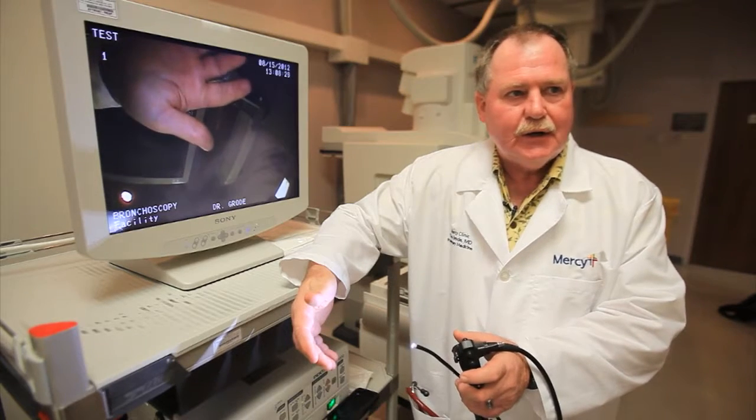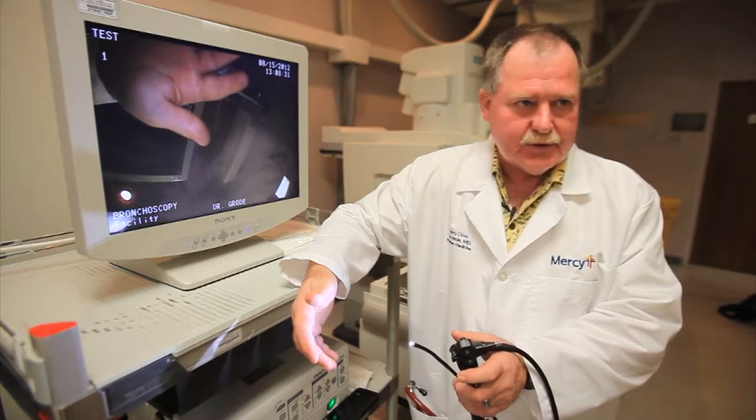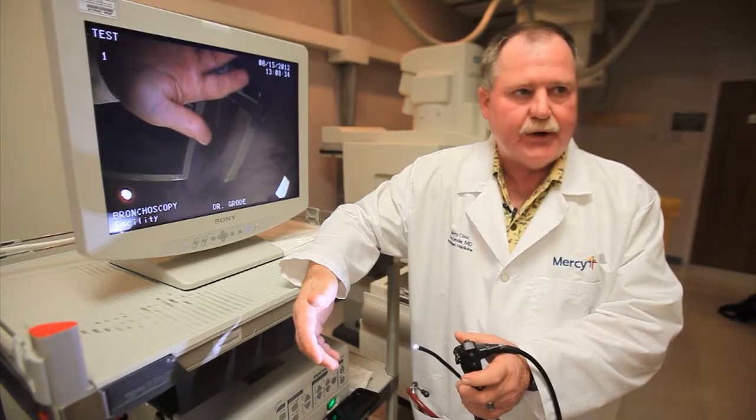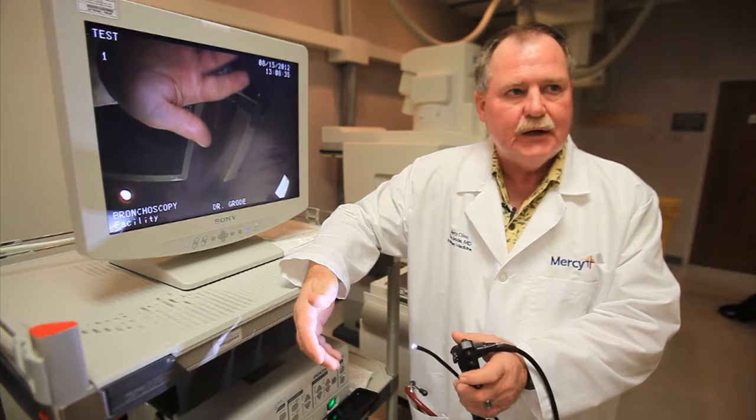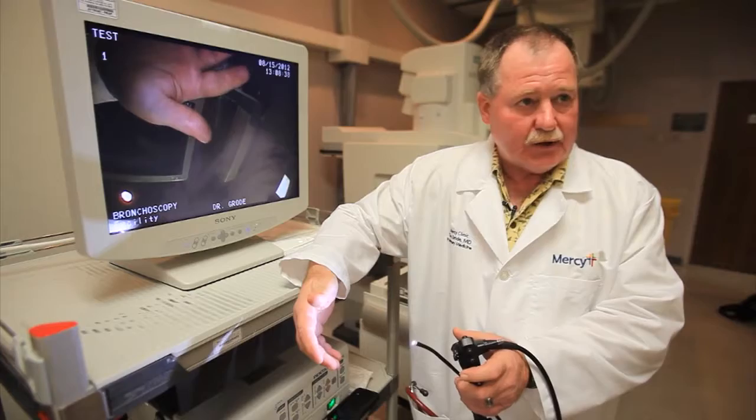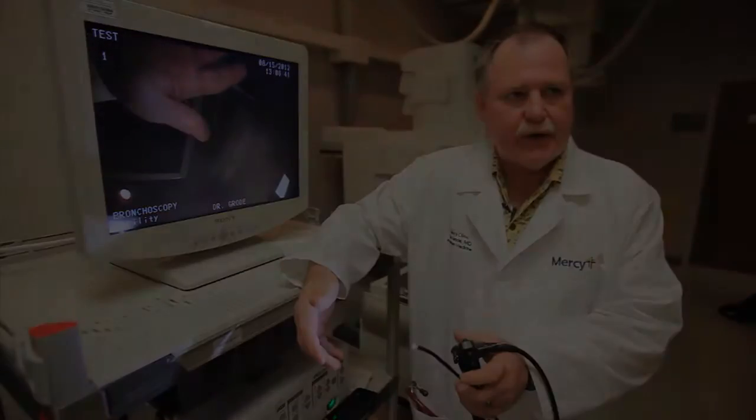We do sedate, or what is called conscious sedation, for bronchoscopy, similar to getting a colon or stomach looked at. Then we put oxygen on and a heart monitor to try to make it as safe as we can.